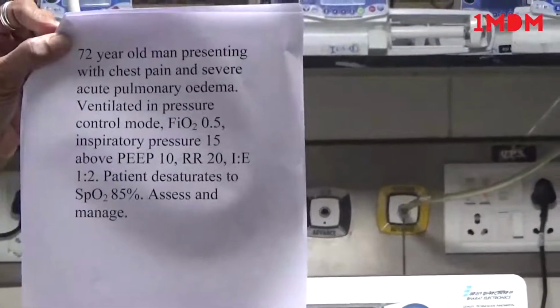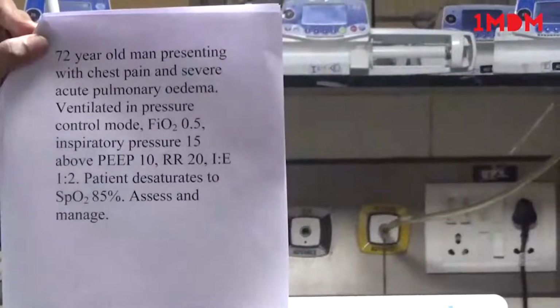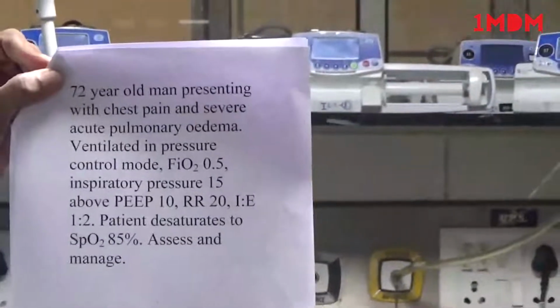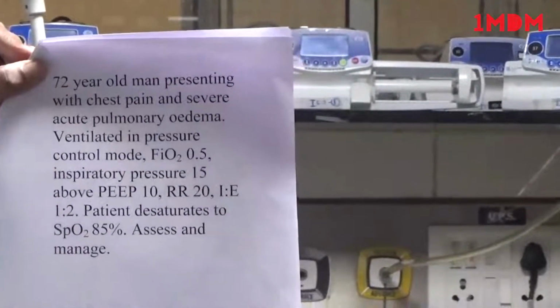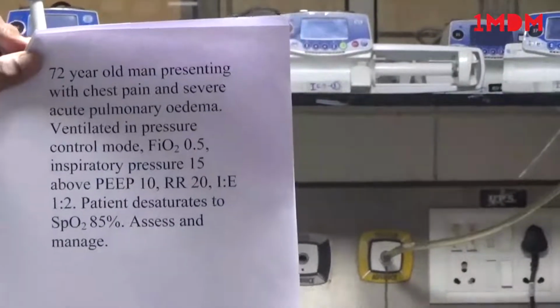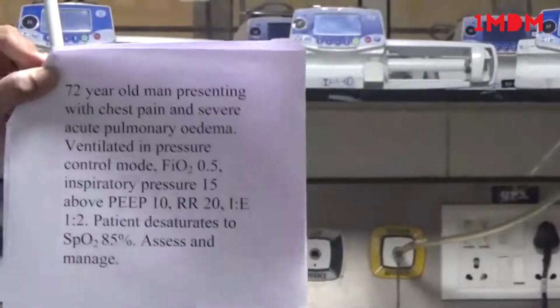The pressure control mode has been chosen just to demonstrate to you how to use the pressure control. The FiO2 was 0.5 or 50%. The inspiratory pressure was set at 15 above PEEP of 10. Respiratory rate was set at 20. I:E ratio was set at 1:2. And once this was attached, the patient desaturated to 85%. So now we have to assess and manage this patient.